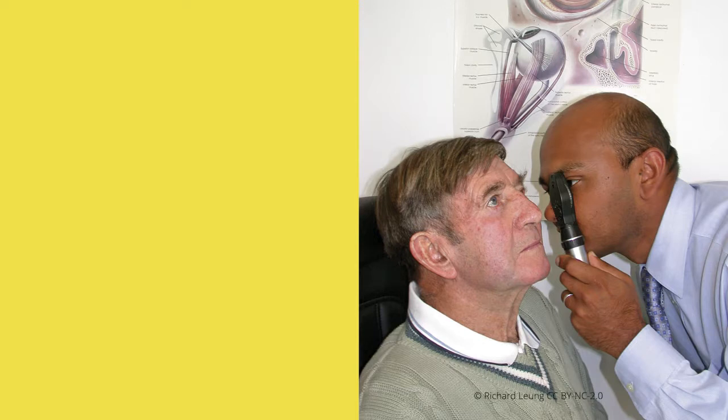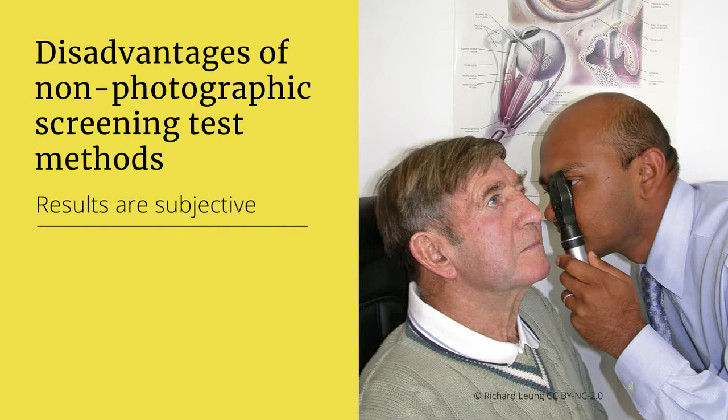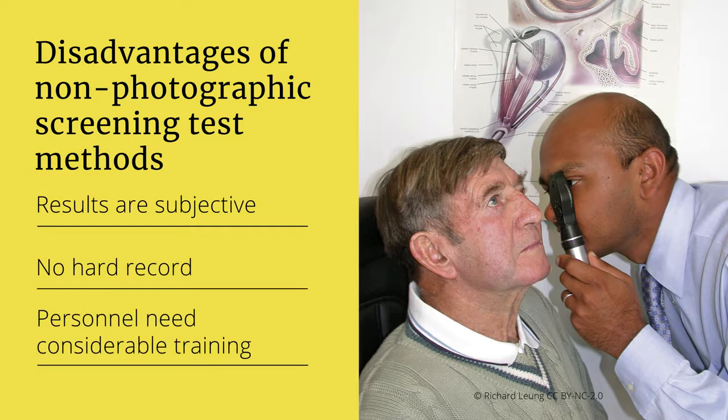Non-photographic methods provide a view of the retina but share some disadvantages. They are subjective, quality depends on the examiner's observation and interpretation. They don't give a hard record, a photograph, for quality assurance audit. And the personnel performing the tests need considerable training.